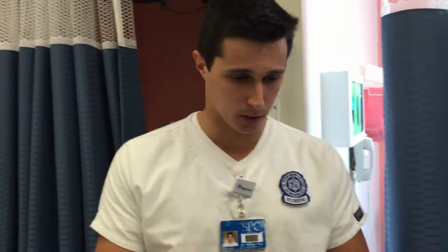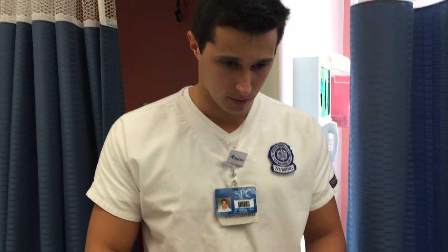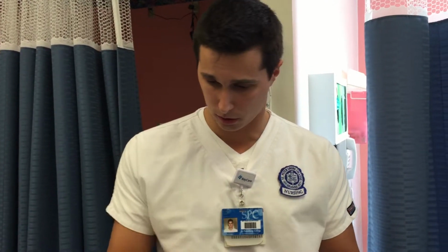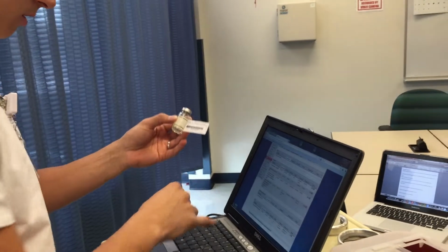All right. So I'm going to look on the MAR here, make sure his medication is at the right time and the right dose. Make sure you got the right patient, the right route. Make sure it's at the time we have to give. So let's see here. The time right now is 17 hours. So we have regular insulin, recombinant insulin, Humulin R. Let's see what we have here. Insulin, regular, recombinant, Humulin R, so it matches.